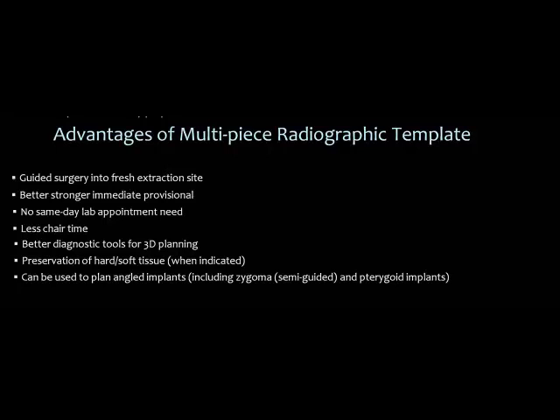No same-day lab appointment needed, so this prosthesis can be pre-manufactured and the patient doesn't have to wait or come back the next day to put your bridge in. The chair time is less. Everything is pre-planned. It's a matter of just making sure we do it sequentially and follow our steps so we don't have any error amplified through the process.